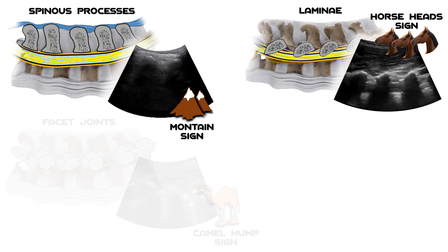Summarizing the signs in the sagittal axis: spinous processes produce the mountain sign, laminae produce the horse head sign, facet joints produce the camel hump sign, and the transverse processes produce the trident sign.